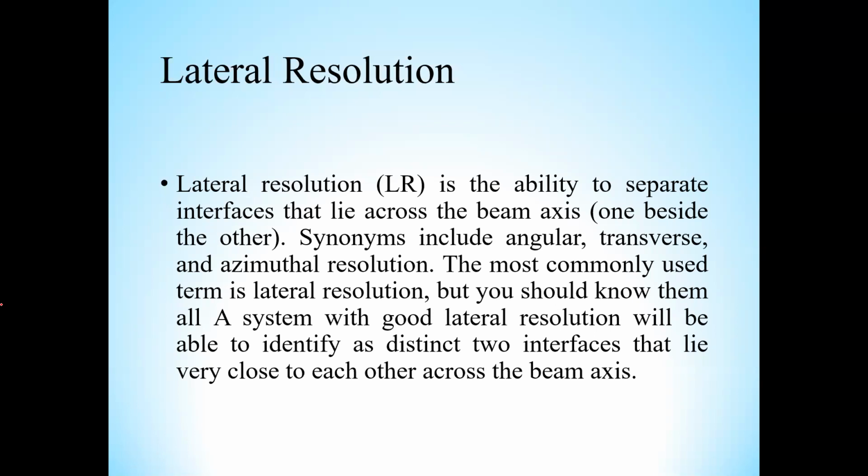Lateral resolution is the ability to separate interfaces that lie across the beam axis, one beside the other. Synonyms of lateral resolution are angular, transverse, or azimuthal resolution.